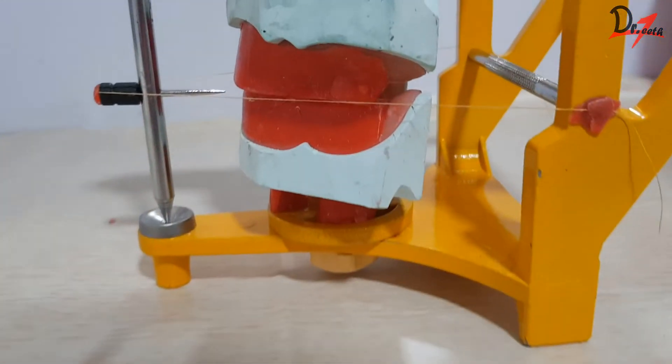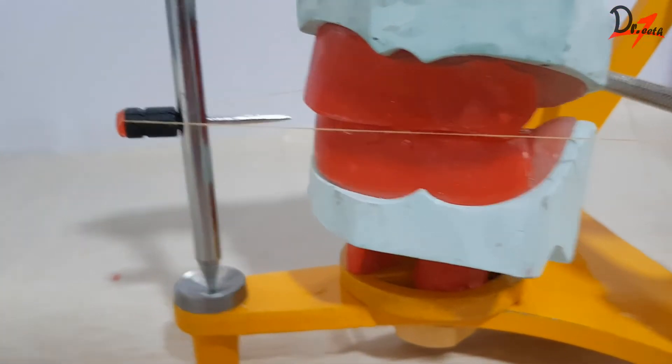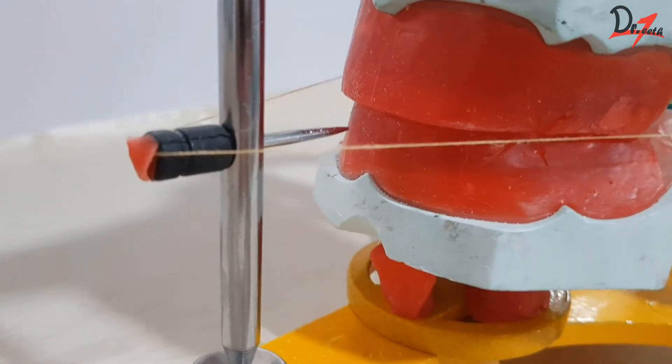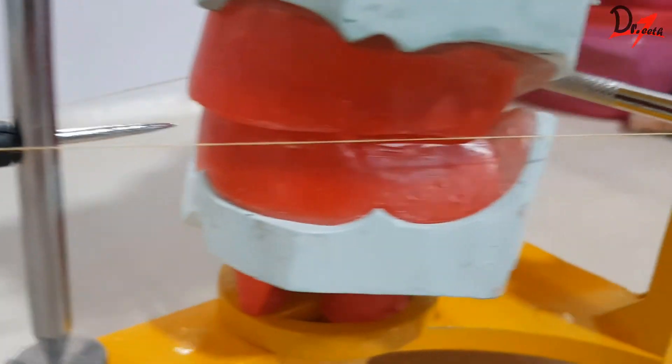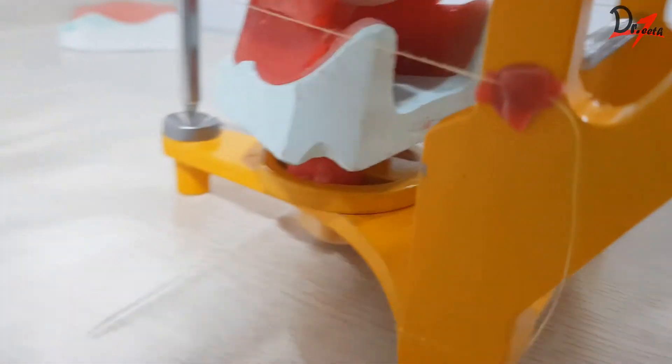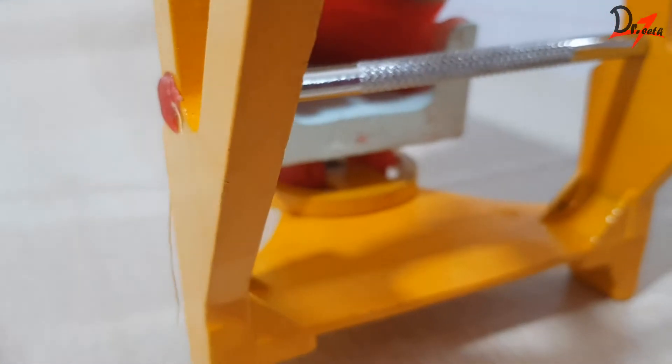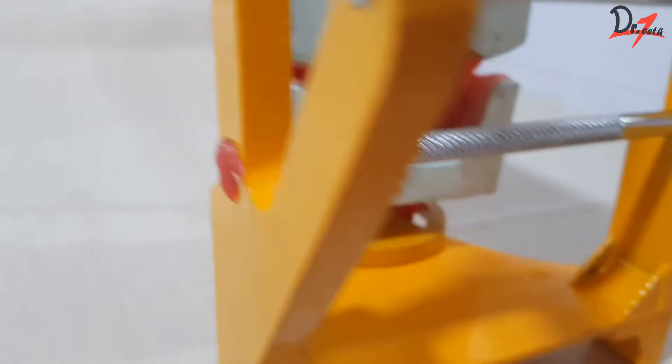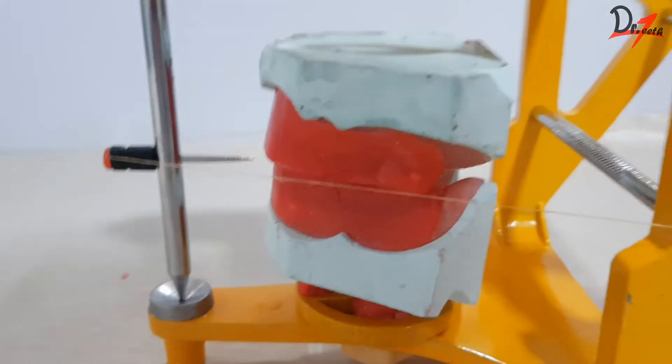So, as you can see here, we have a thread going from the central pin posteriorly till the reference rod. And on the opposite side also, we have the same thing from the central pin to the posterior rod. So, basically, we are creating that triangle with the help of a thread.